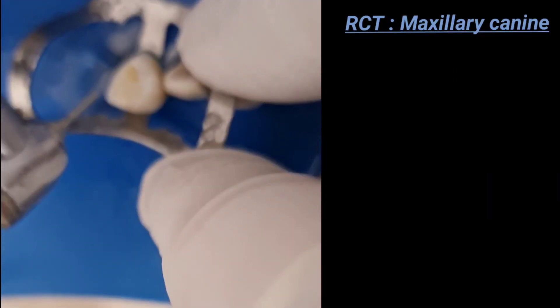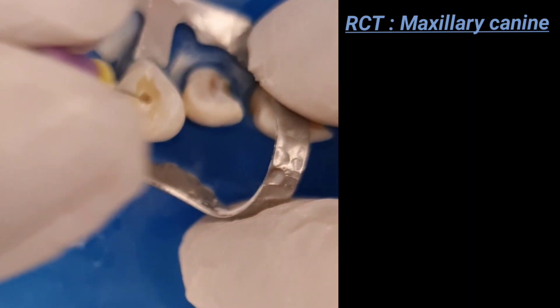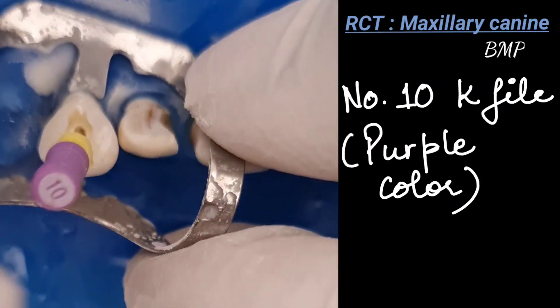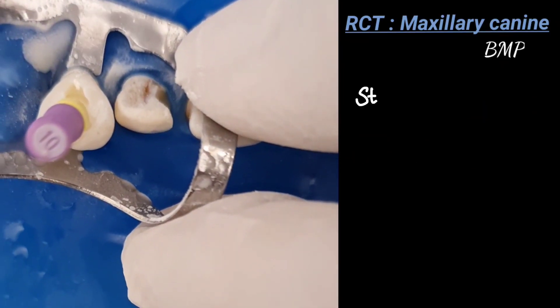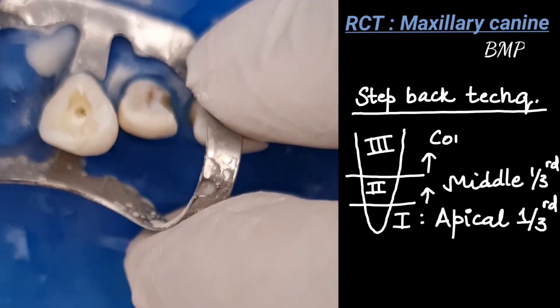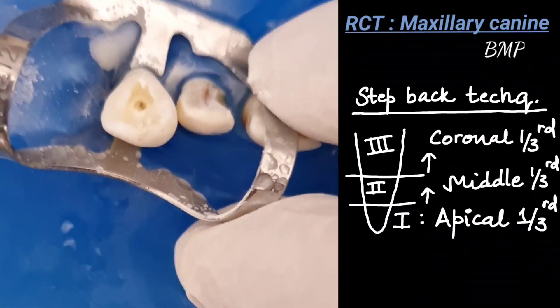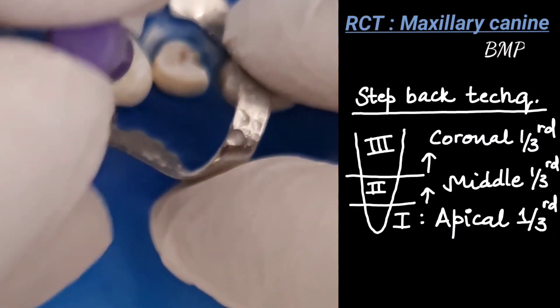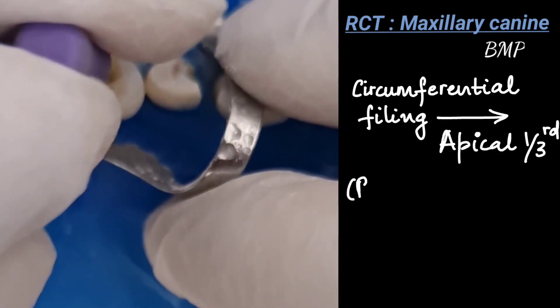The cross section of the pulp chamber is ovoid. A number 10 K-file is inserted directly through the canal orifice. In this video we are doing BMP with a step-back technique using hand files. In the step-back technique, phase one is apical one-third instrumentation, phase two is middle one-third, and phase three is coronal. The first preparation is apical instrumentation, done with circumferential filing.